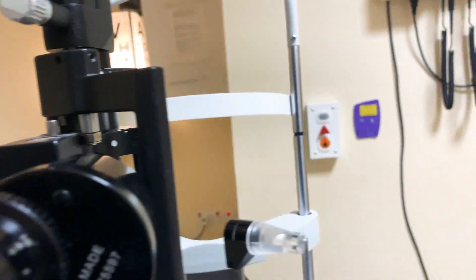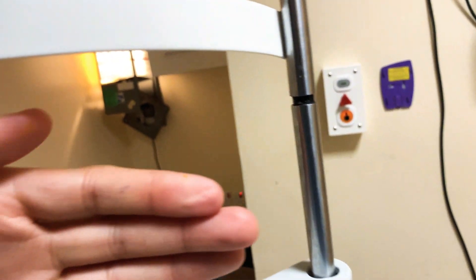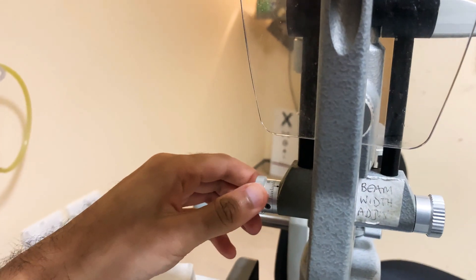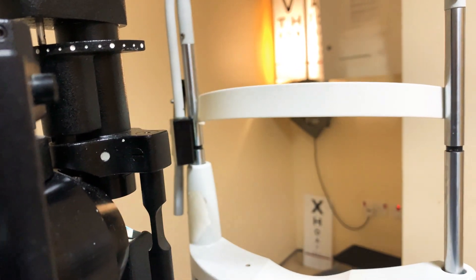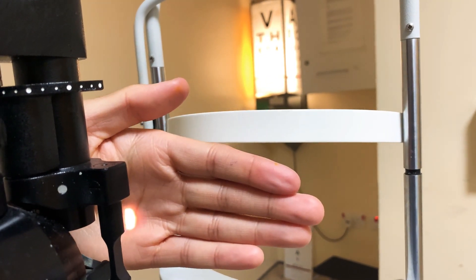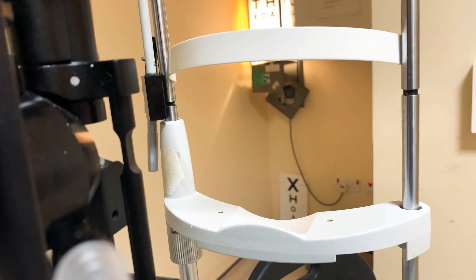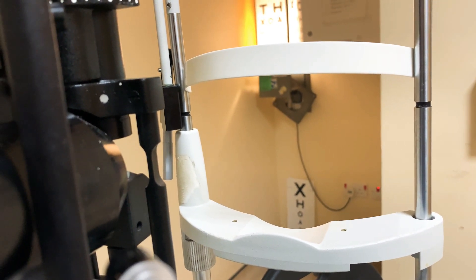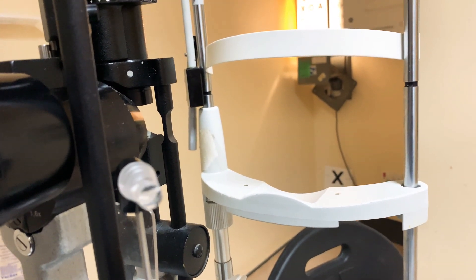Next stage: turning on the beam. There's a label here saying 'beam width adjustment' — that's the most important thing. If you're not getting any beam, you need to widen it. You can reduce it to become even thinner. Sometimes it helps to have a nice narrow slit to appreciate the cornea and its different layers, versus a wide diffuse beam.